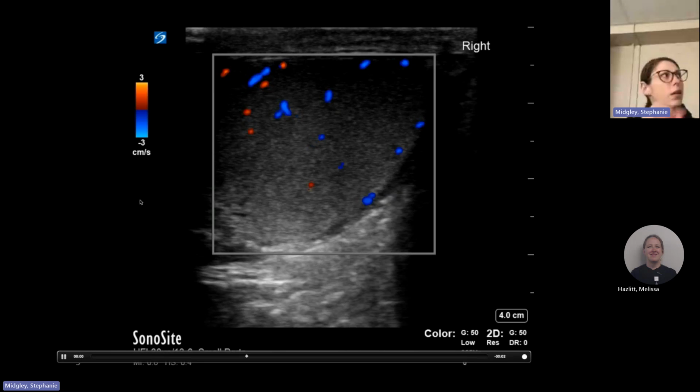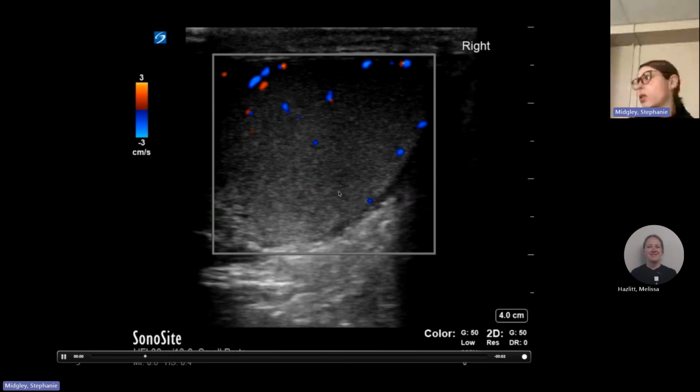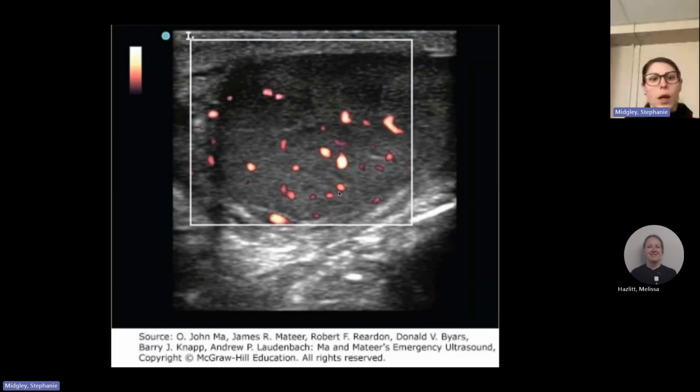And then on the gain box, when you're on the color, you can adjust the gain so that you can bring it up or bring it down based on what you're seeing. The other option you can do is color power Doppler. So now it's not giving you directionality of flow, but just giving you flow in general. This is a little bit more sensitive, but doesn't tell us artery versus vein.